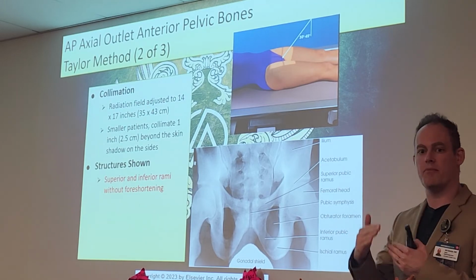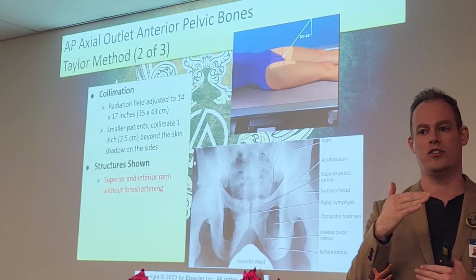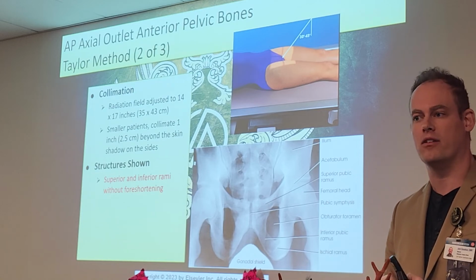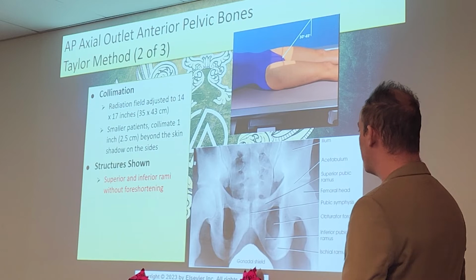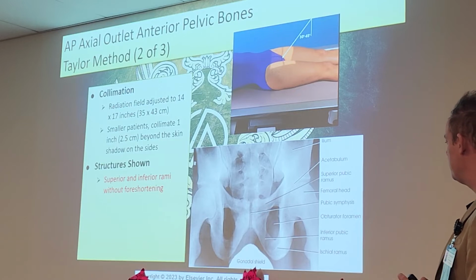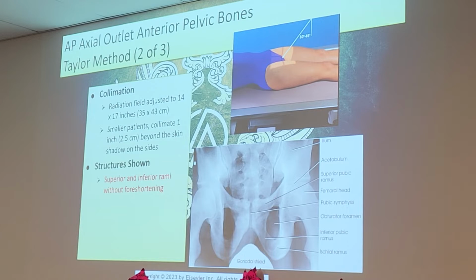As you can see, it looks massively stretched out. Look how big the obturator foramina look. So if you saw a picture like that on your test, with those obturator foramina very stretched, the outlet's very stretched as well. That's key for that Taylor method, or that outlet view that we're talking about. And obviously it's centered much lower as well. The pubic symphysis is also elongated. A pretty x-ray, kind of neat looking.